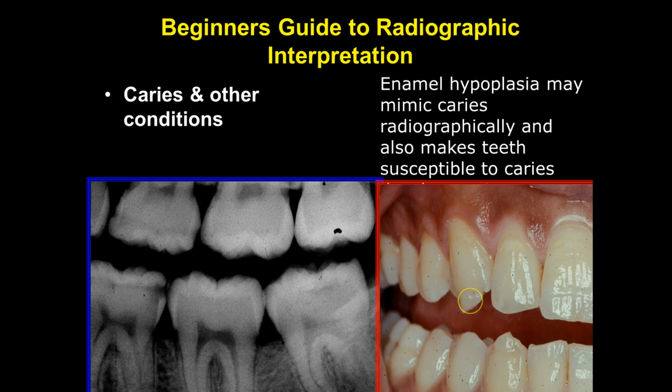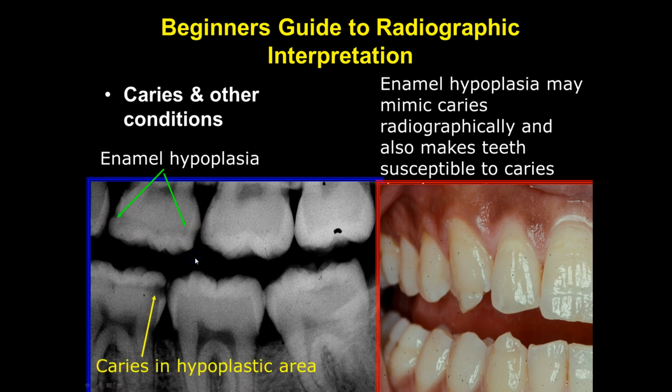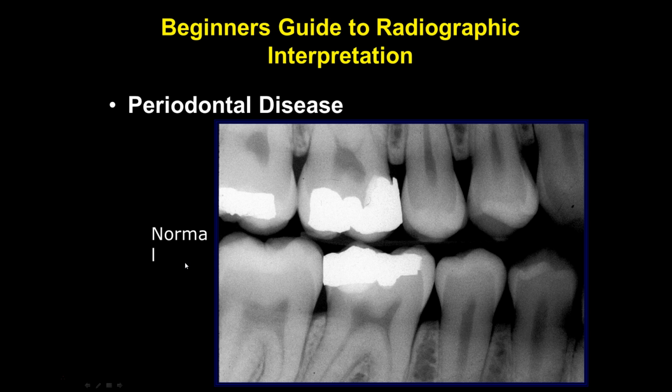The other reasons are many. You never know until you take an accurate medical history to determine what is up with the patient in their dental history and medical history. So the hypoplasia that appears on here, this tooth appears very irregularly shaped. Therefore, it would cause you to go and look clinically. Obviously, a significant carious lesion here at a weakened spot.